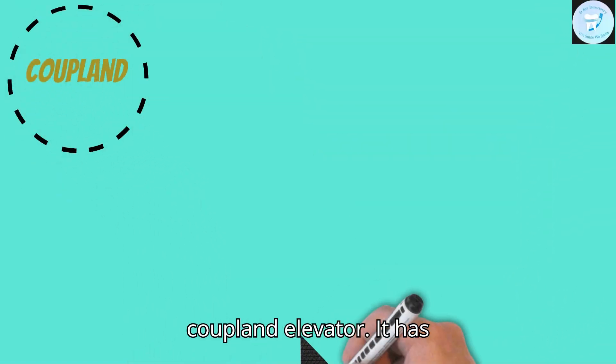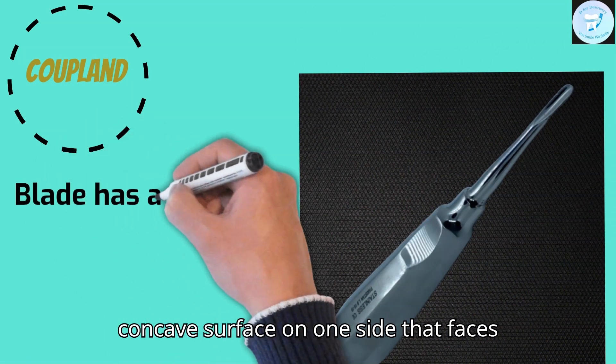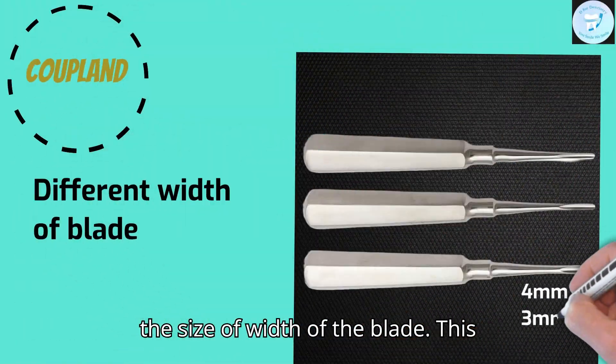This is a Coupland elevator. It has a concave surface on one side that faces the root or tooth to be elevated. It comes in different sizes according to the width of the blade.